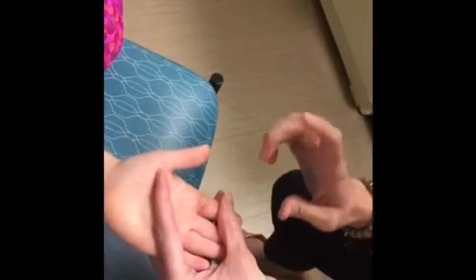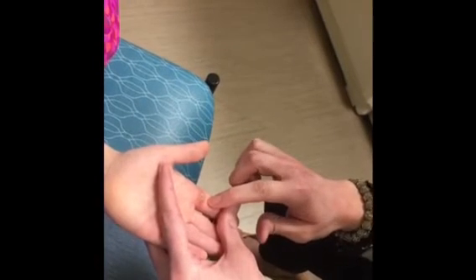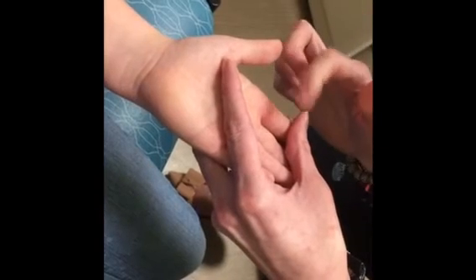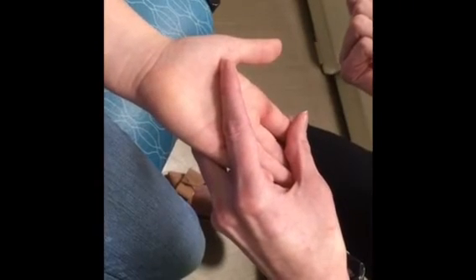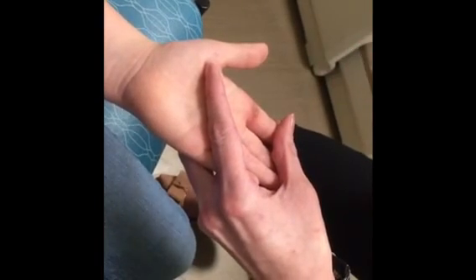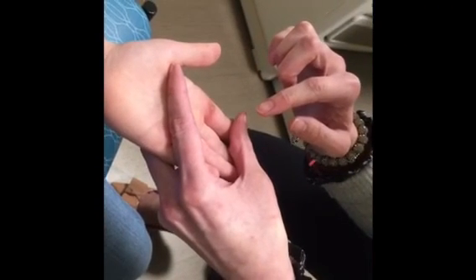So what will happen from here — it probably won't blister up because of the location, but it's possible it could, because we traumatized it. And so it will turn into like a darker scab look to it. Then two weeks from now, get a metal nail file and try to file it down if that scab doesn't come off. Hopefully it'll scab up and just fall off and the whole thing's gone. But in four weeks we'll retreat it — we'll do the same thing — and then hopefully that's all it'll take.